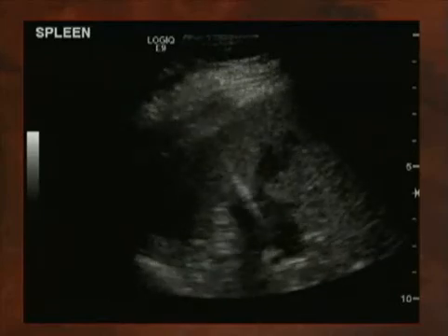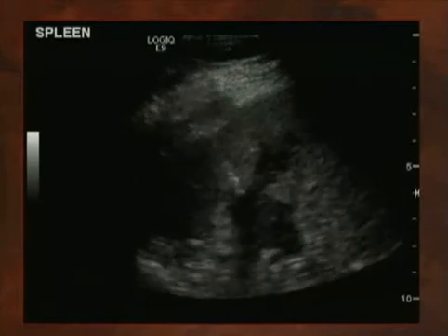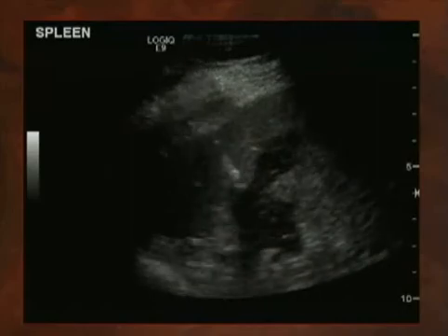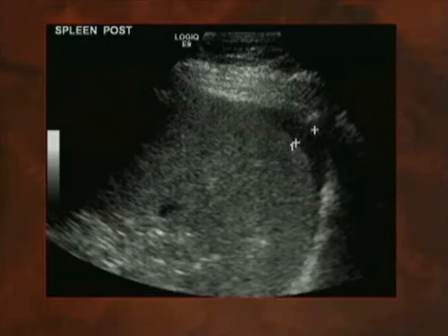Well, in this case, we agreed to go ahead and do a core needle biopsy, and this is a short clip of the biopsy taking place. This did turn out to be positive for recurrent lymphoma. After the biopsy, you can see that there's a small hemoperitoneum that developed in the perisplenic space. We followed this patient very closely, repeated scans a couple of times afterwards, and this never got any bigger. He never had any symptoms, and he was discharged from the hospital later that day.